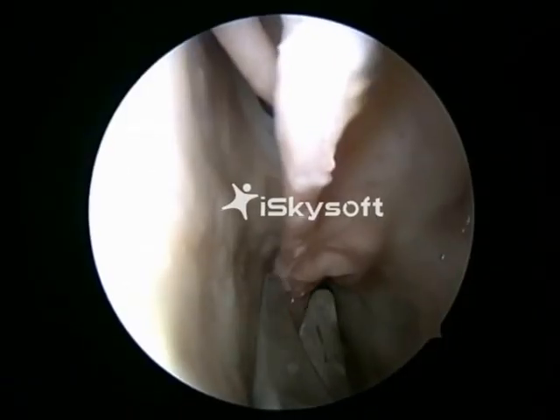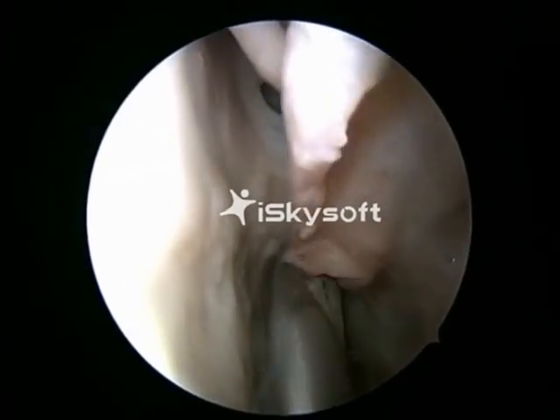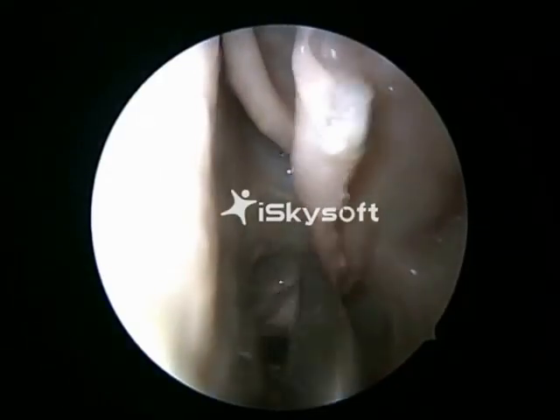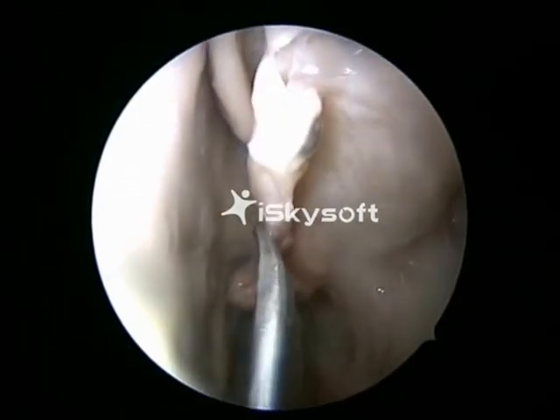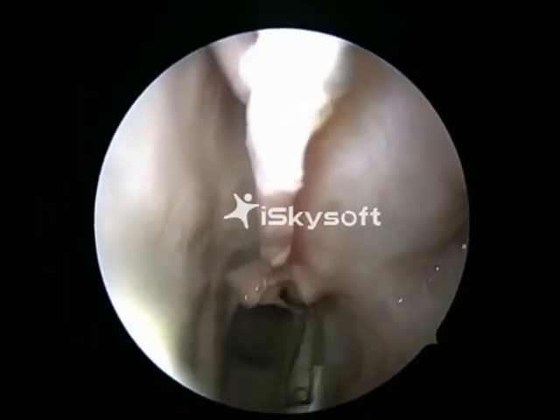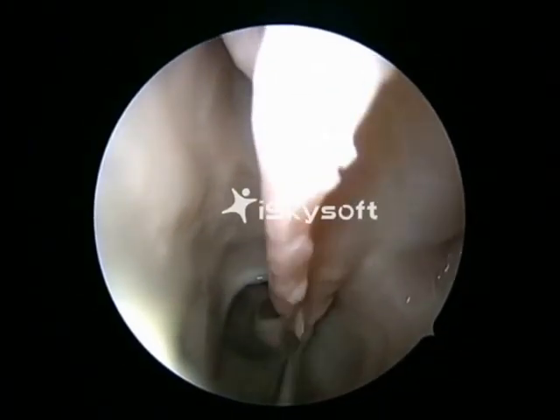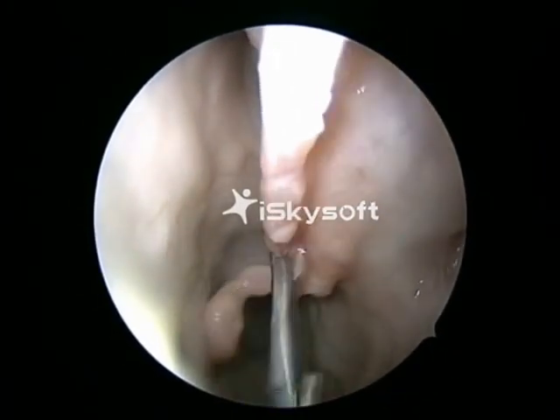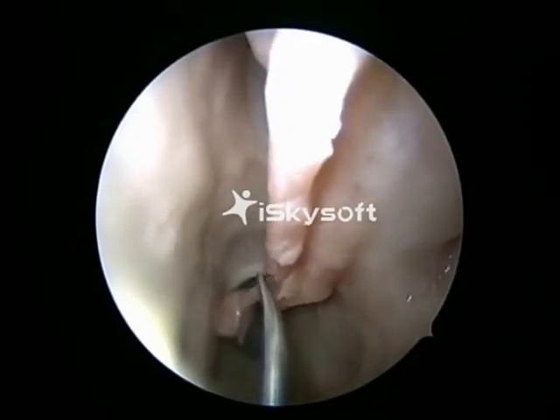This flap is the workhorse for surgeons venturing into the anterior skull base surgery. That's the posterior end of the middle turbinate being excised. In fact, we can have a glimpse of the sphenoid ostium and the superior turbinate there.